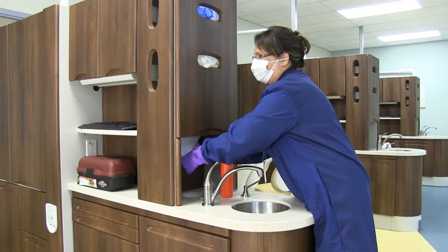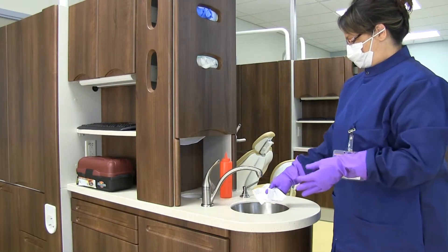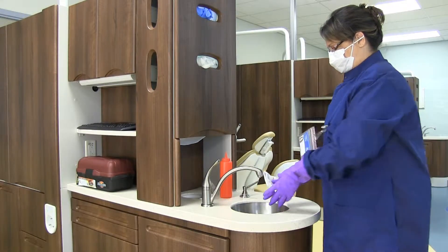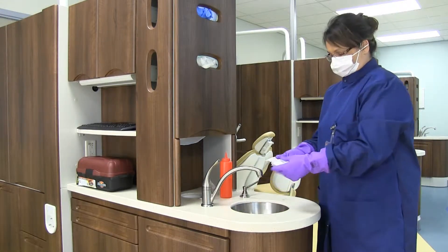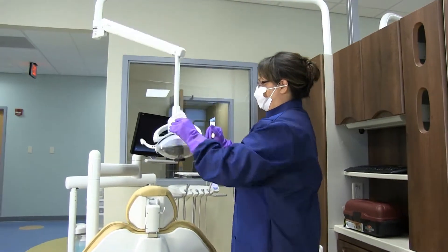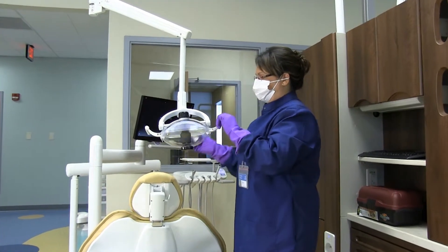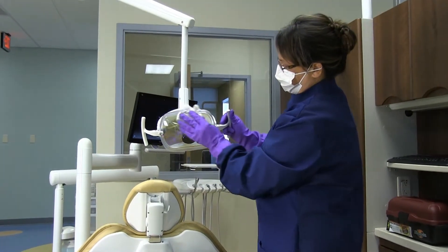Next is the water wipe. For the water wipe, proceed in the following manner. Start with the light handles and cover, and then the rheostat. You'll gently use a dampened paper towel to water wipe to remove any cloudiness on these areas from the disinfectant.